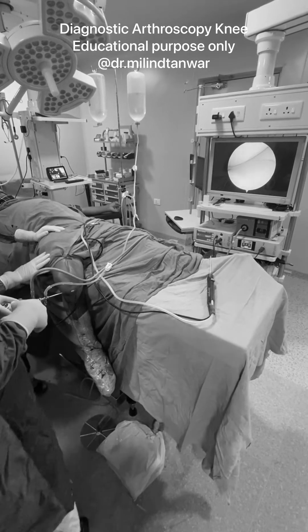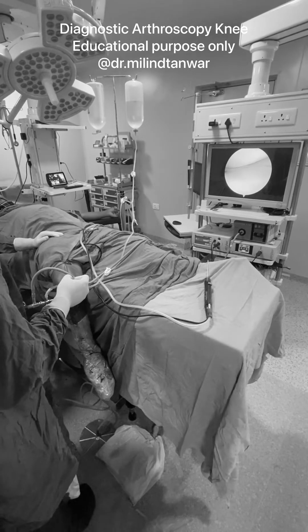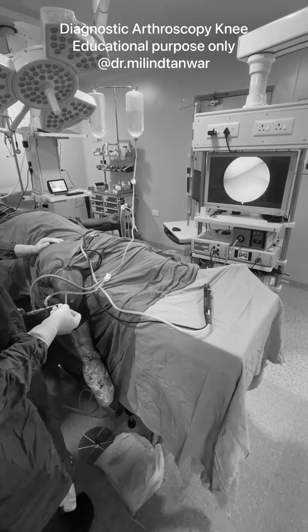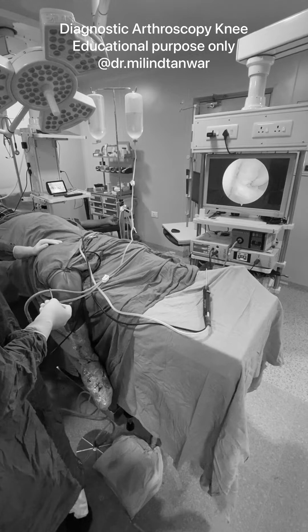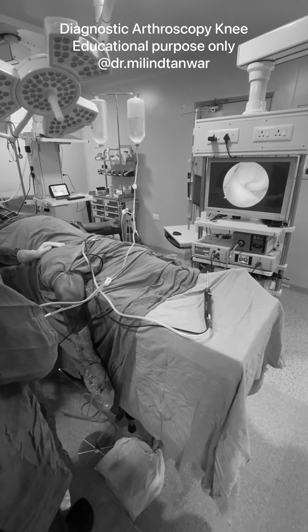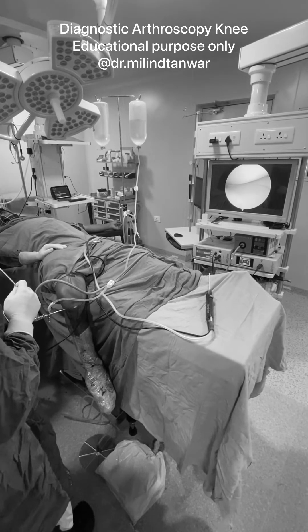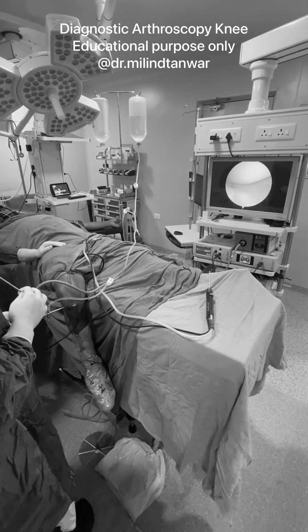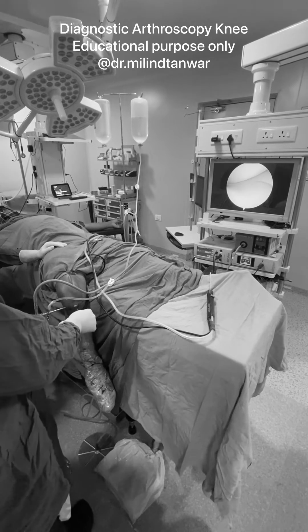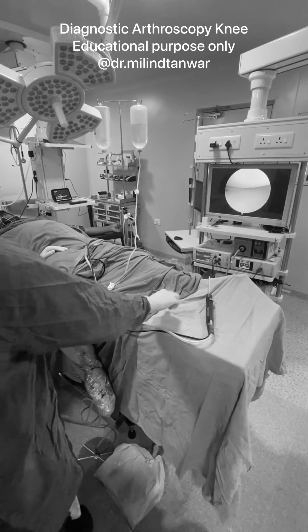A common problem people face is how to open up the medial joint space when there is very low joint space, and how to visualize and go about a meniscal repair. This is a normal case where there was a loose body and it has been removed. The ACL and PCL are absolutely normal. Doing a meniscal repair or meniscectomy is far more challenging than doing an ACL reconstruction. To open this joint, you place your scope right in the medial compartment.